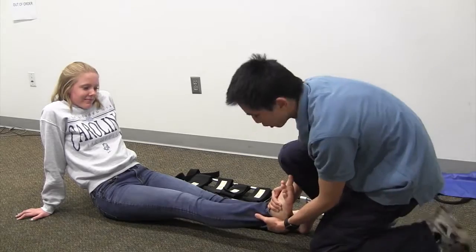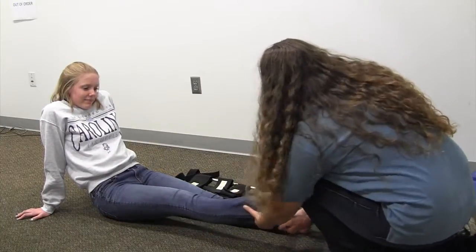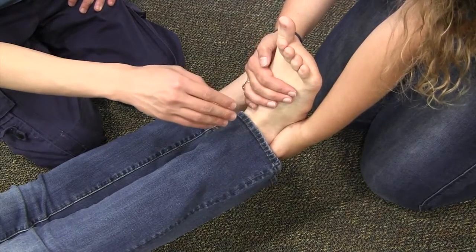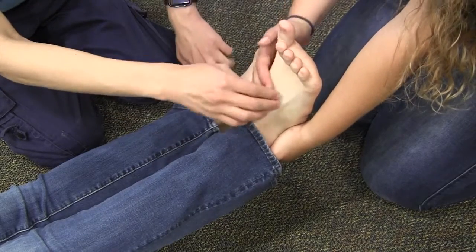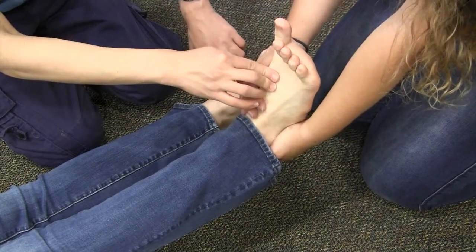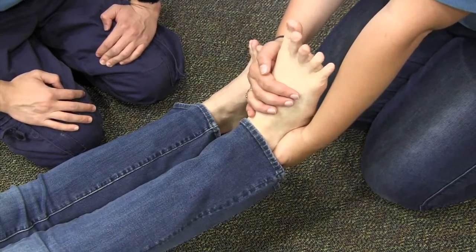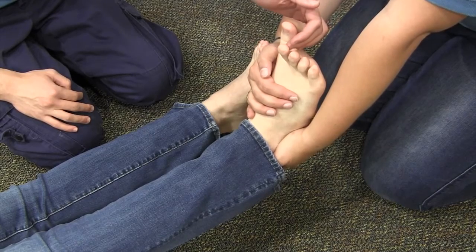My partner is going to come and hold manual traction for me. After my partner has taken manual traction, I'm going to measure PMS — I'll feel the pulse on both feet, then ask the patient to wiggle their toes for motor function, and then touch a toe and ask which toe it is to assess sensation.